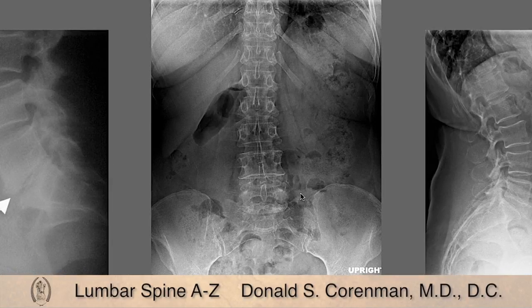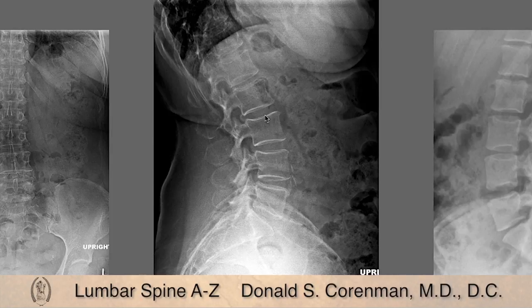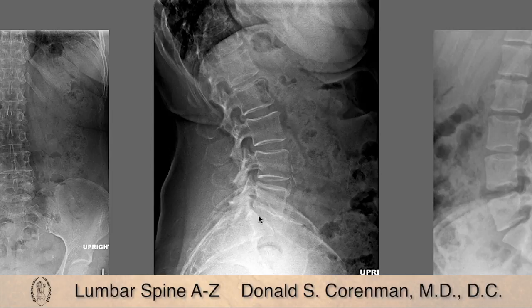When you start to get disc narrowing on the AP, it's not easy to see, but you can start to look for alignment changes. For example, at L2-3 there is a slight angular change indicating some degeneration on the left side. And at 5-1, which is always difficult to see on an AP, there's still some sclerosis and narrowing — so you might judge there is some degenerative change at 5-1. On the lateral, the disc heights should cascade larger as you go down. These get larger, larger, larger, and then somewhat narrowed, so you can make an assumption there are some mild degenerative changes.